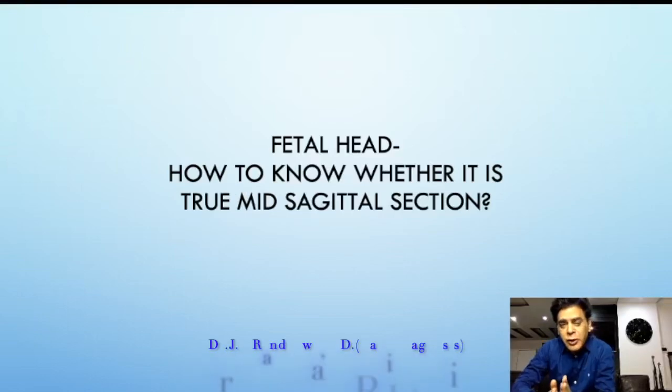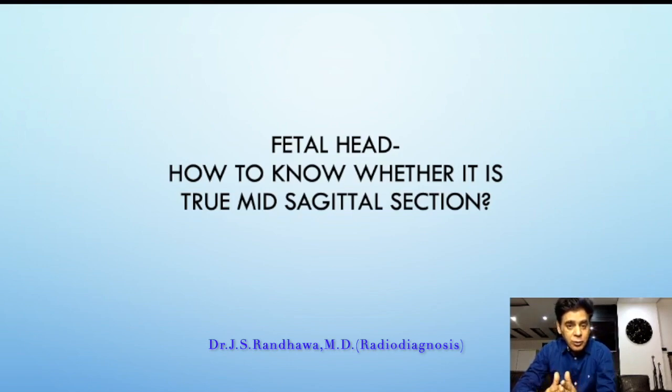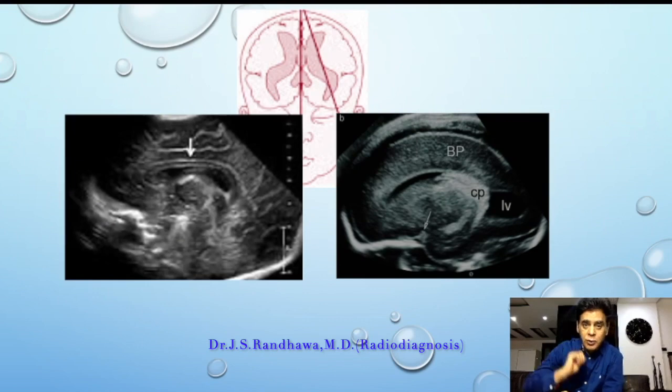So today a very short tip of fetal head, when we are taking a section, whether it is a true mid-sagittal section or it is a parasagittal section. Now this is important. Why? I'll tell you that. Now let us go on to the picture and you'll be able to make out.